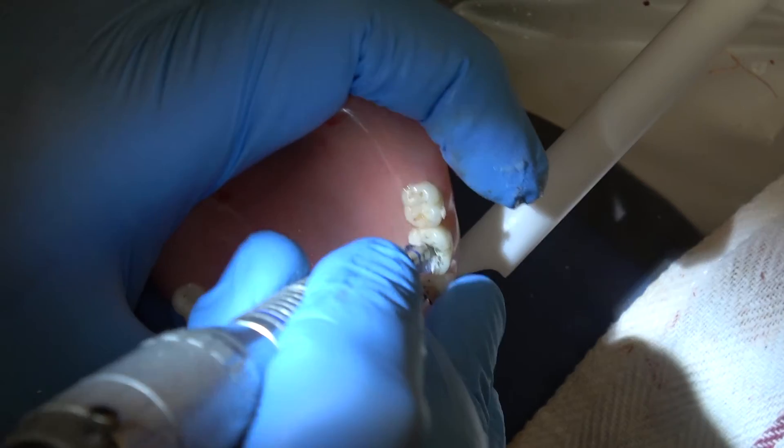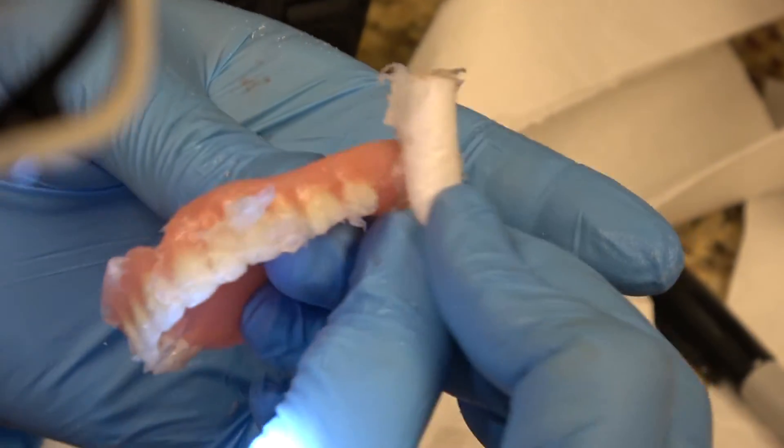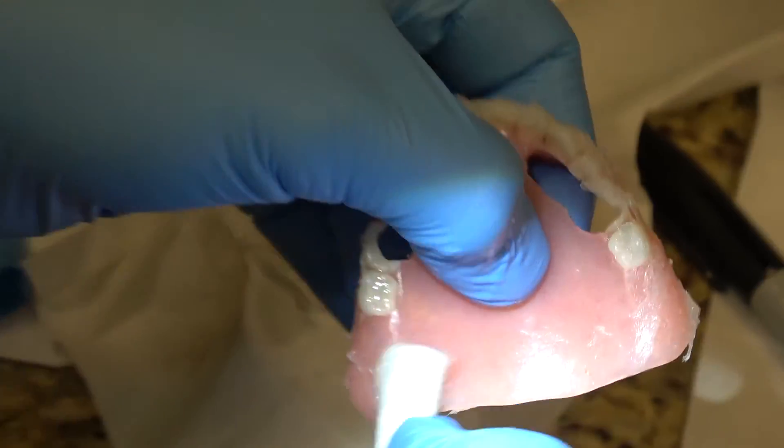You want the holes to be much larger than the implant size so you don't have to mess with seating it for a long time. Once we place the denture in the mouth, you can see the implants, and I'm going to mark any areas that I need to adjust a little bit more, and just adjust these just a little bit more.